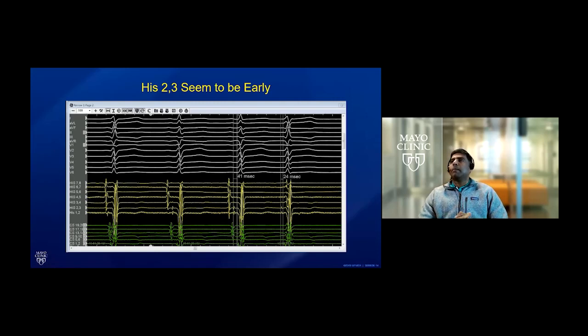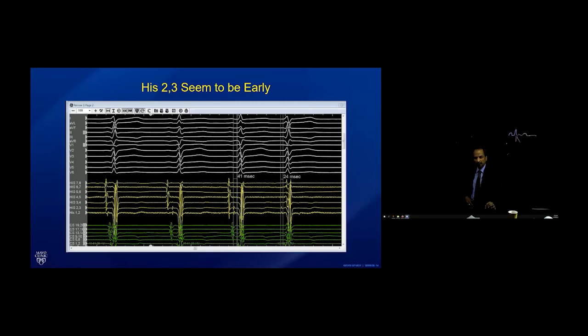I think that's a fantastic explanation. Maybe I'll just draw a figure here to illustrate that, and then any other points that anyone would like to make, please do. So really a very simple but effective point that Dr. Mulpuru has made. Comparing the same point, so it's one point that we're mapping, and we have a signal or a set of signals, but we're comparing that point in two rhythms.